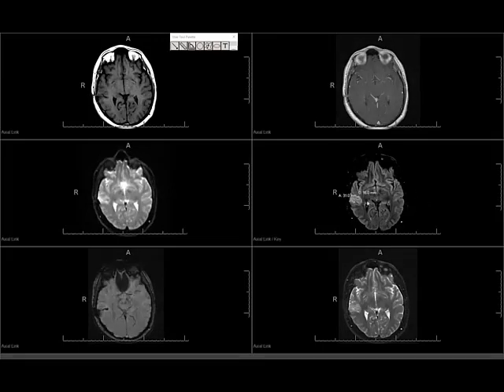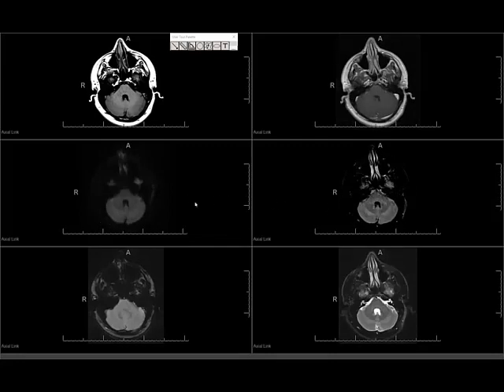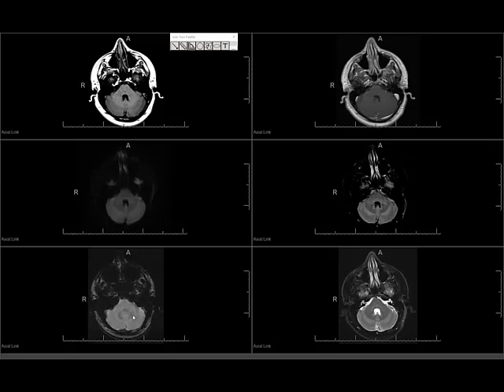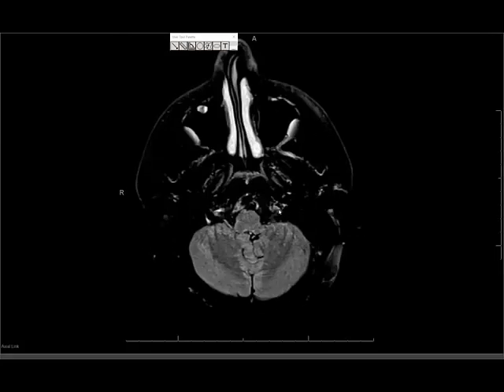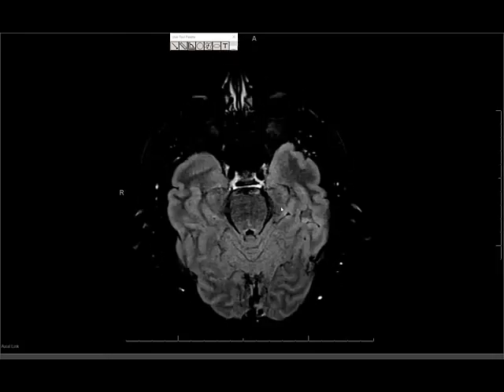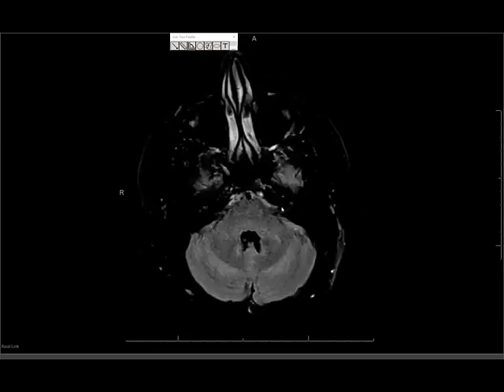I always start with the FLAIR sequence, though some people like to start with the diffusion sequence. Either way is fine, because the majority of pathology can essentially be figured out on these two sequences. One advice: when you're starting off, please don't scroll too fast. I see this done by residents all the time. You want to look at this sequence very, very slowly, looking at every image, particularly at your stage.